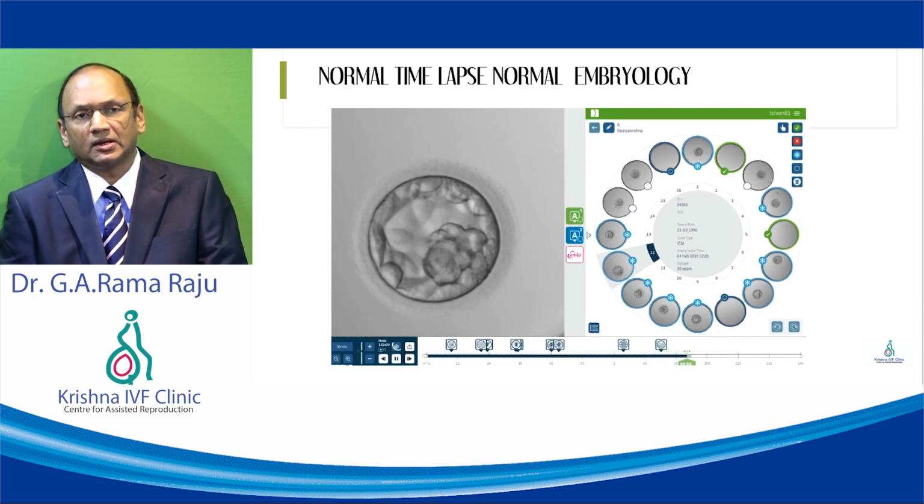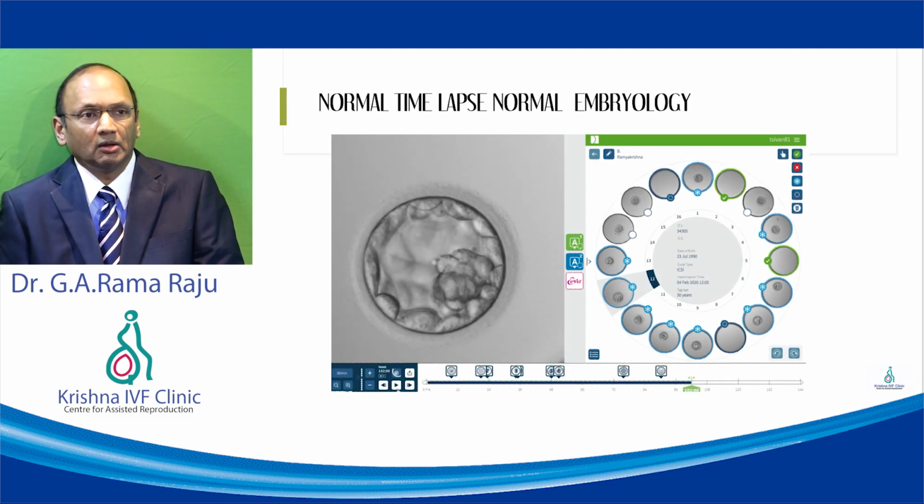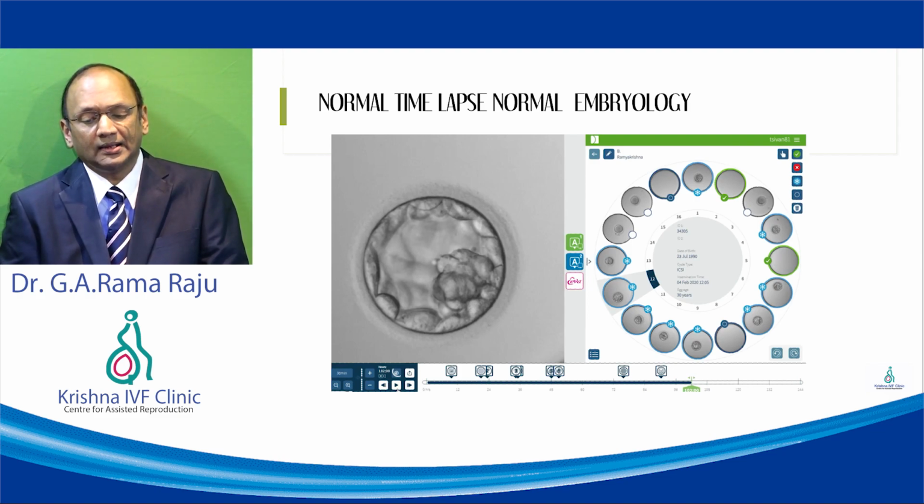So everything can be recorded for all the oocytes. The model which I use has one chamber for one patient, and it has 16 wells which contain 16 oocytes for one patient, and they can be monitored in this way.